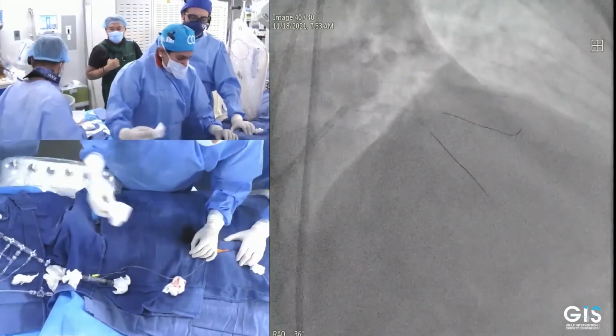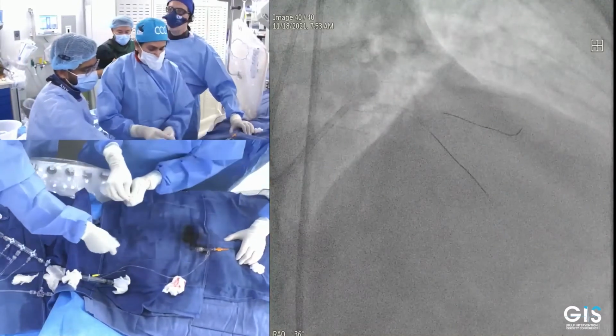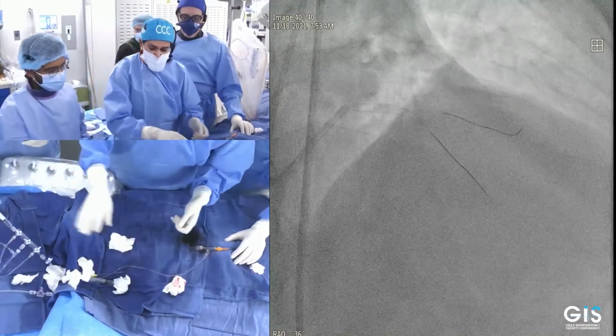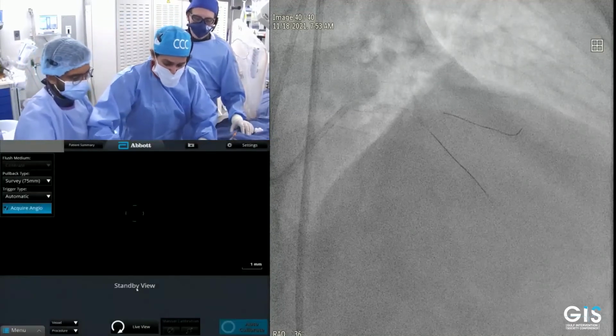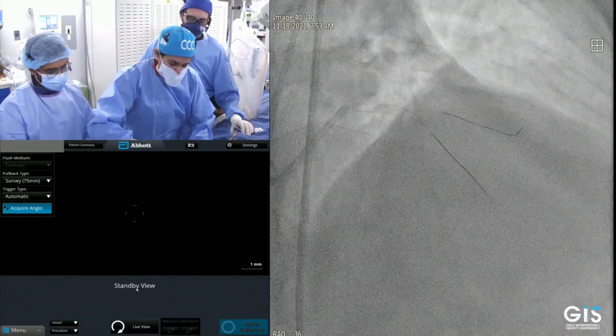All right, we're going to do the OCT in the LAD now. We have about a few more minutes for the transmission. So we're making great time. We still have the wire in the LAD.